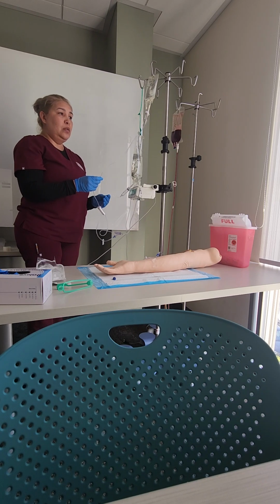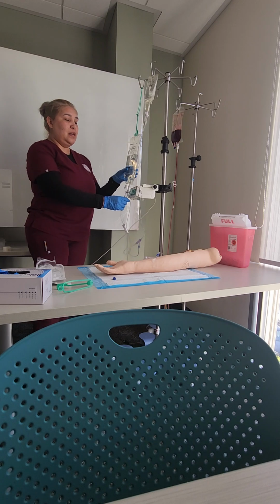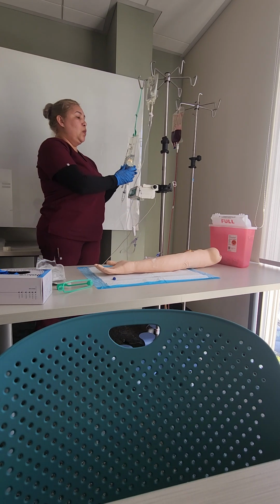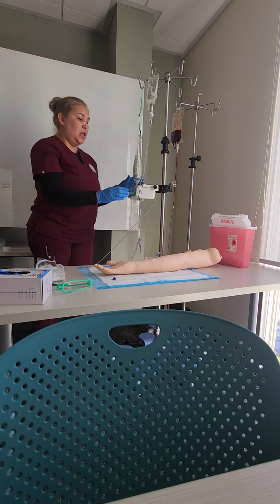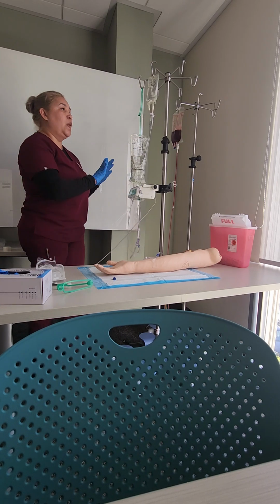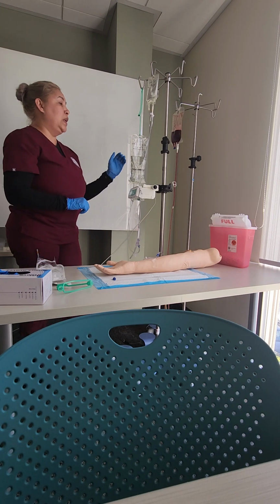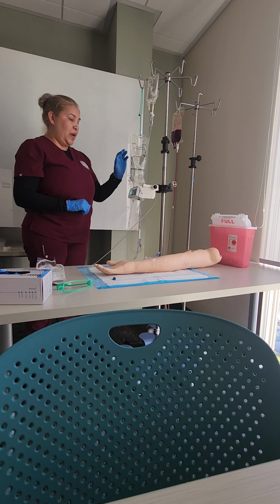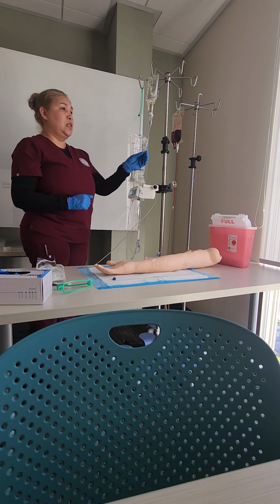Now what I want to do is initial, time and date both of my bags, so that anybody that comes in and checks will know what time these bags were being put in. And now I want to document in the MAR exactly what I did. I want to document that I put in a primary, the rate, the volume that was infused, and at what time it was done.